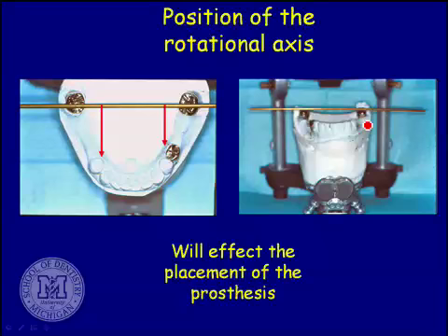And that can cause you problems on how you would block out or how well it seats on the anterior teeth. So it's basically the position of your rotational axis, both in terms of is it straight across and also is it level? Because again, imagine that you were on two different teeth here and it was pronouncedly angled that way. That would affect how the rotation happens.